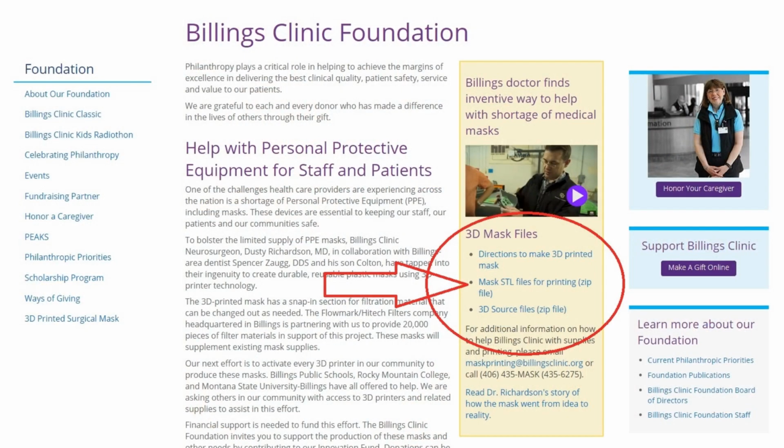So what is the printer making? Masks, or mask housings, really. You see, somebody forgot the 5 Ps and now there's a potential mask shortage. These mask housings were designed by a team of doctors where I live. Here's the website with a link to the files if you would like to print them yourself.